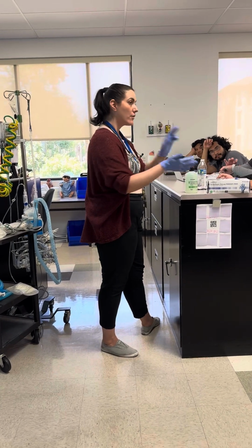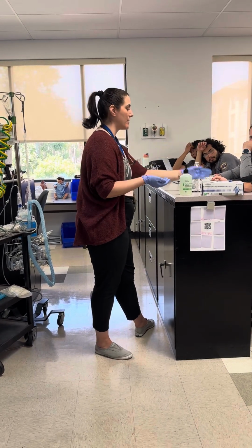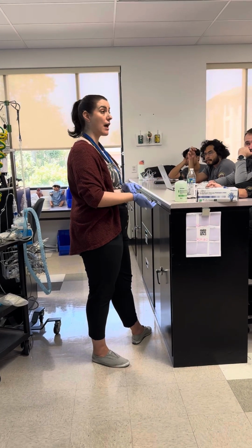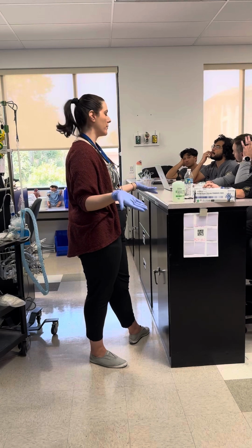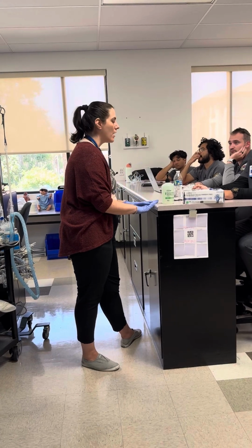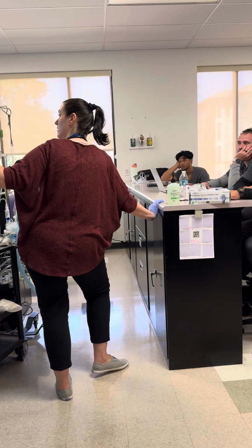So you'll have correlated the information. So now at this point, you have obtained breath sounds, you've obtained a saturation, and you've obtained a heart rate that you trust. At this point, a student always likes to ask, do I use the number that I got or the number on the machine? It doesn't matter. If they're correlating, then both numbers are pretty trustable. So you'll mark the value that is pertinent to your comfort. And then at that point, the value that is missing is the respirations and the sputum.